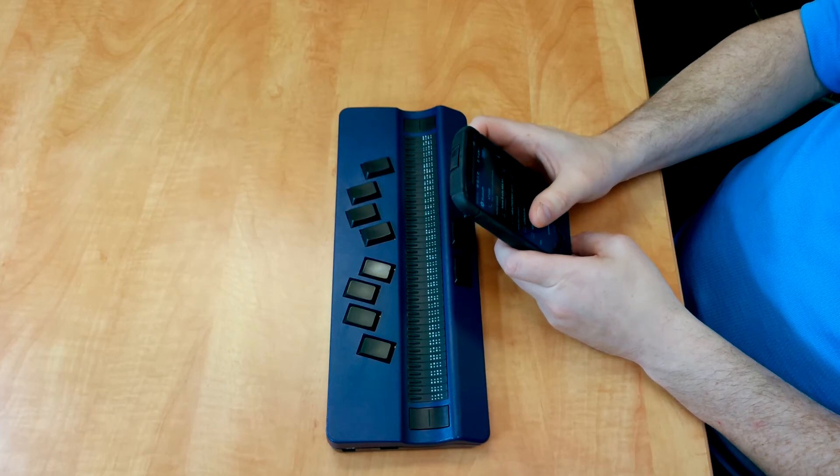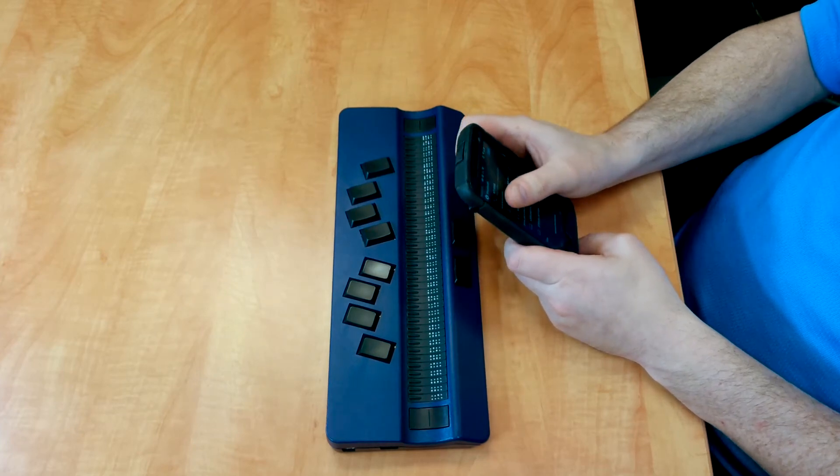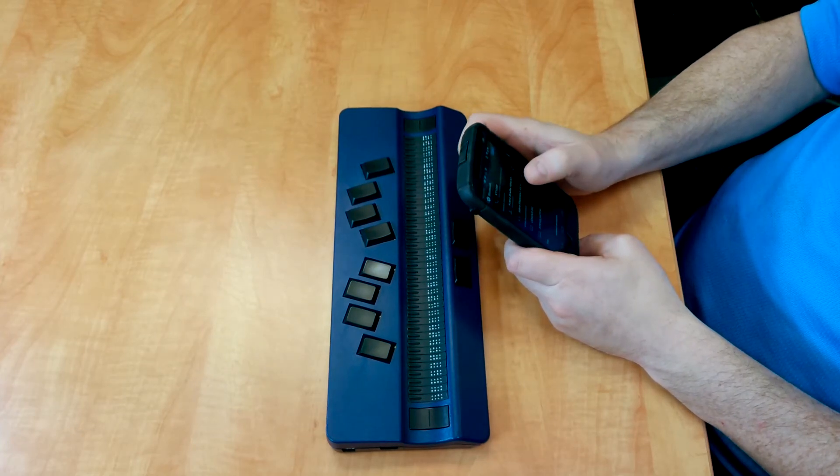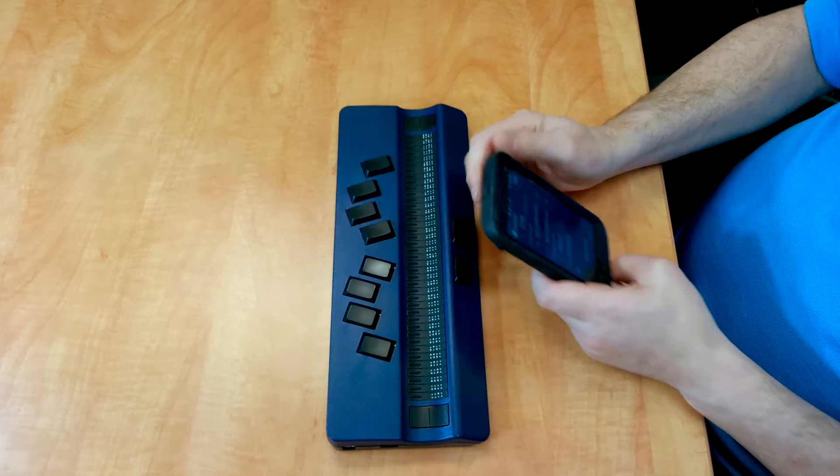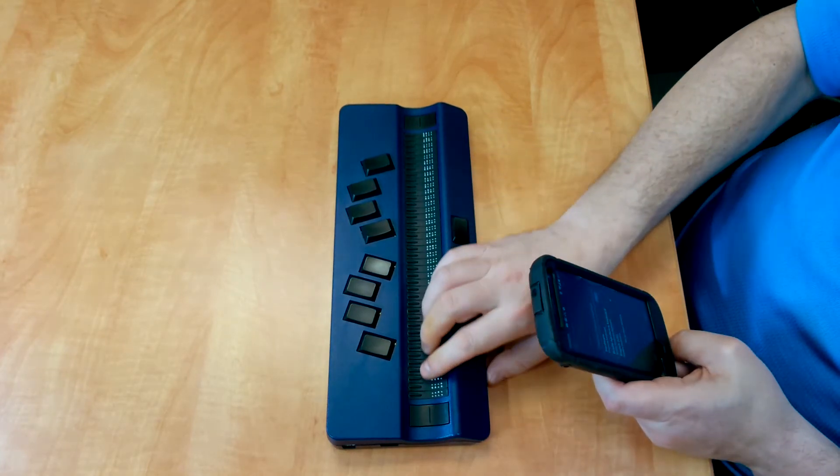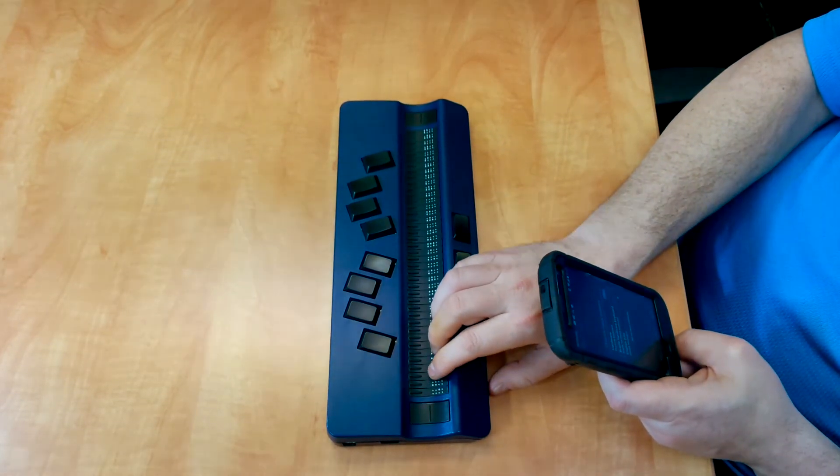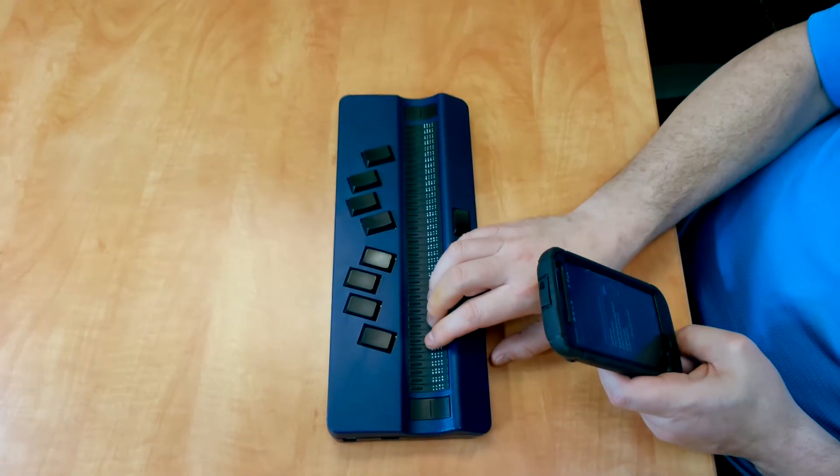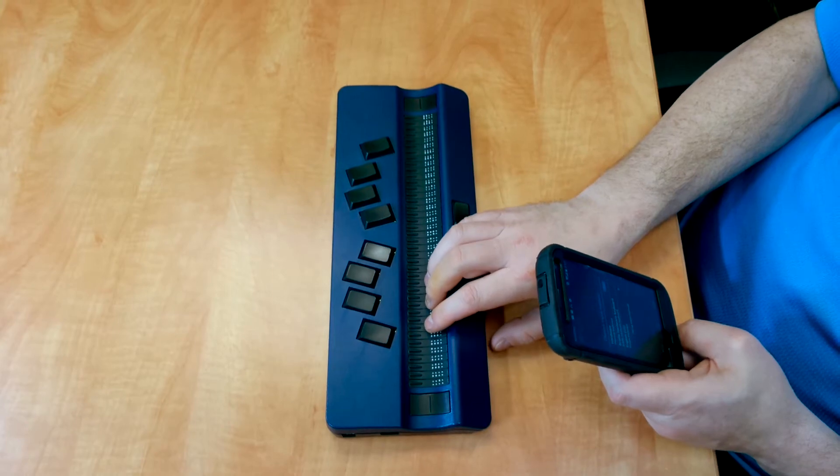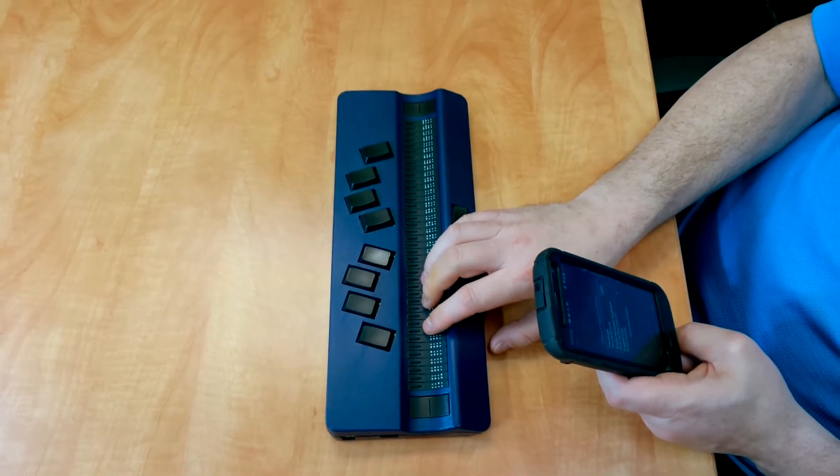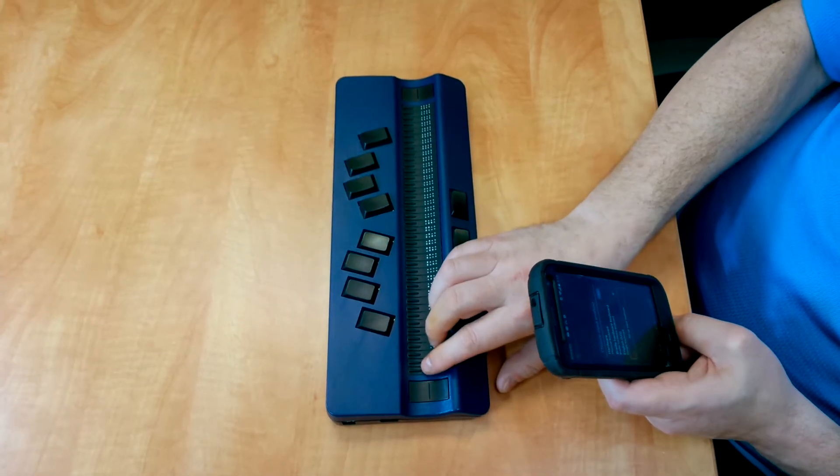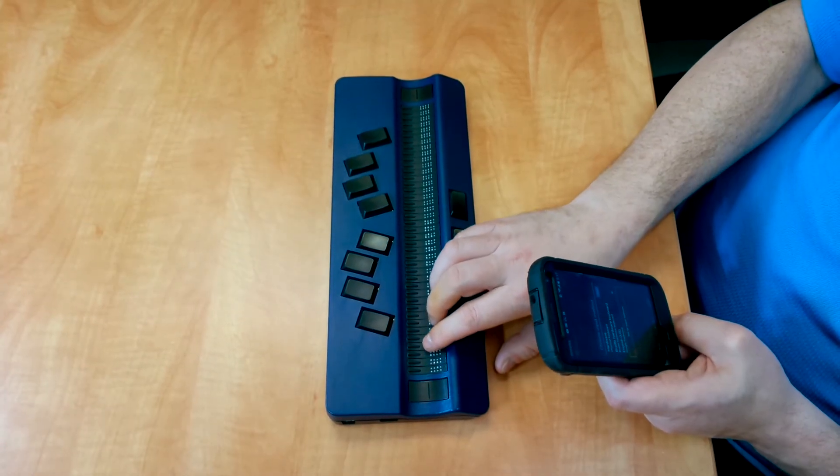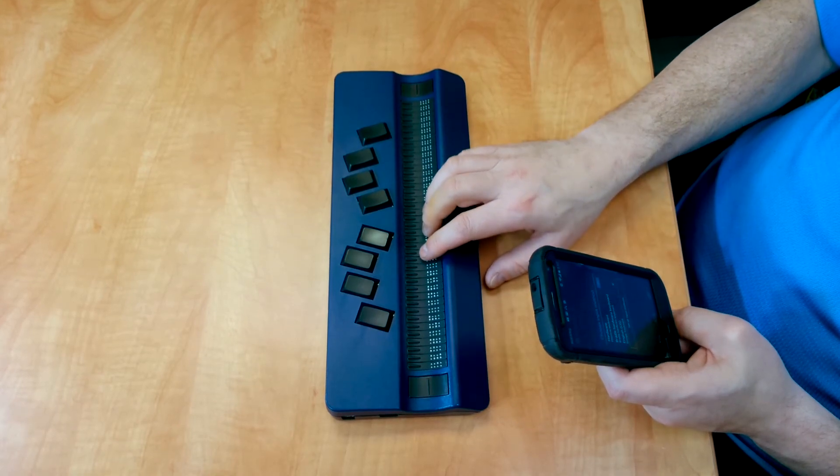if I swipe the screen on my Android device. Bluetooth. Navigate up. It says Bluetooth, and my Braille display is actually tracking along with my phone. So everything that my phone is saying is showing up on my Braille display.